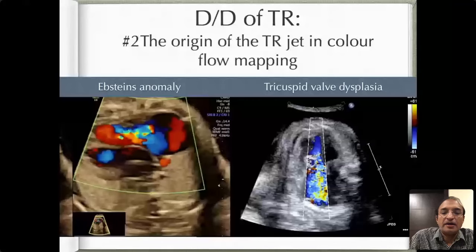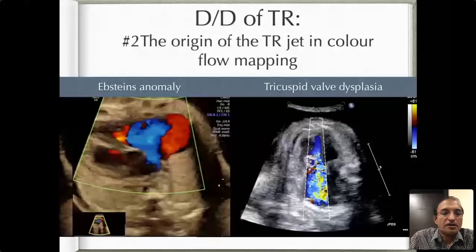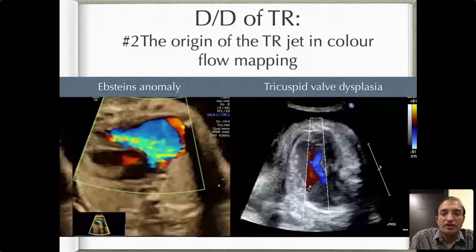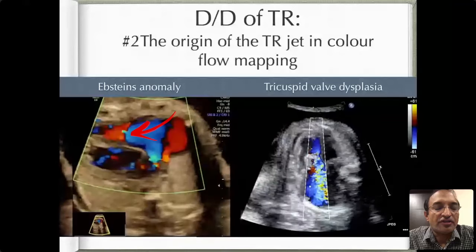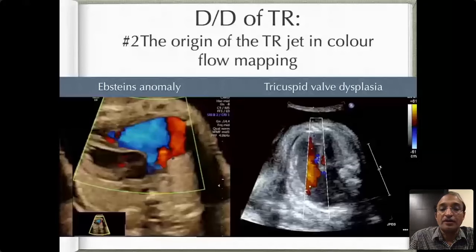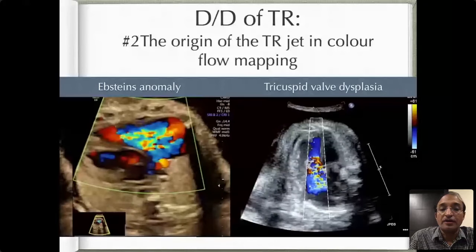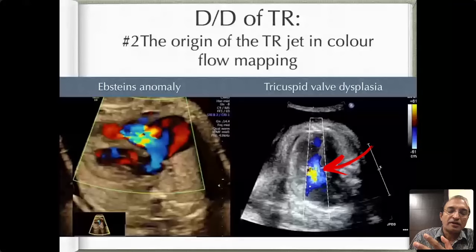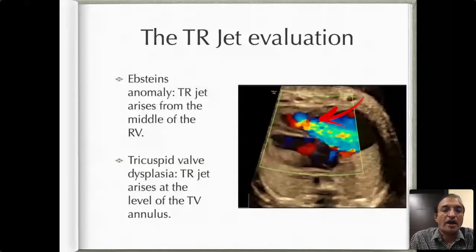The second is a simple visual clue. When you look at the origin of the TR jet in color, you see that in Ebstein's anomaly — even though we call it tricuspid regurgitation — the TR seems to be originating somewhere in the middle to apical portion of the RV, because the tricuspid valve is displaced downwards. However, in tricuspid valve dysplasia, the TR will begin at the level of the normal tricuspid valve where it should be. You can see from the still picture that in Ebstein's the TR jet arises from somewhere in the middle of the RV cavity.